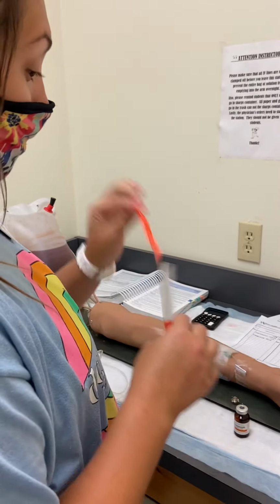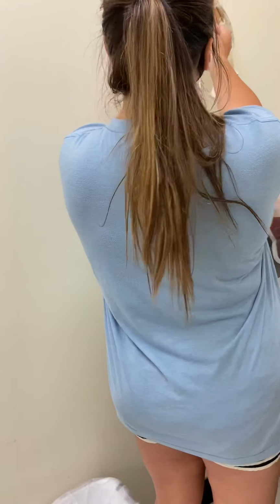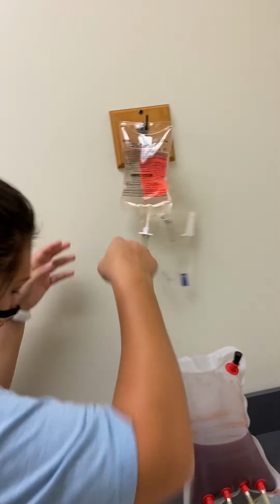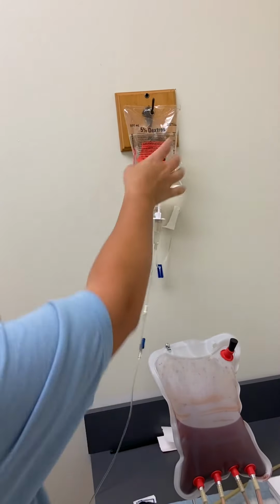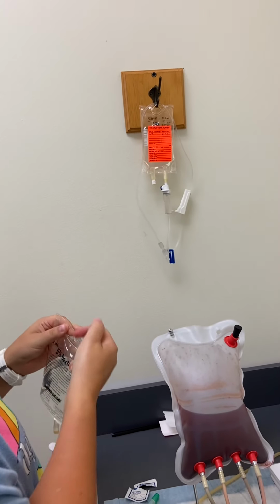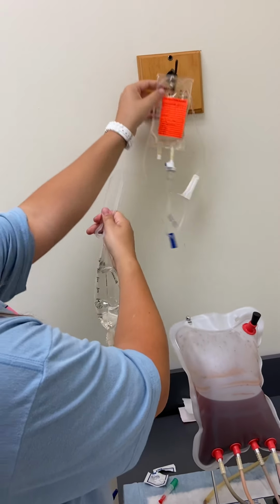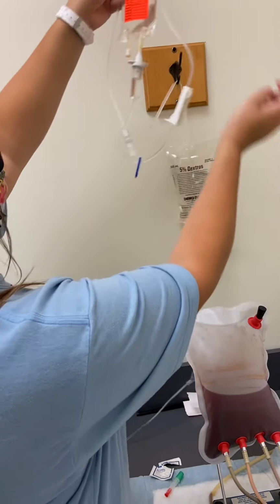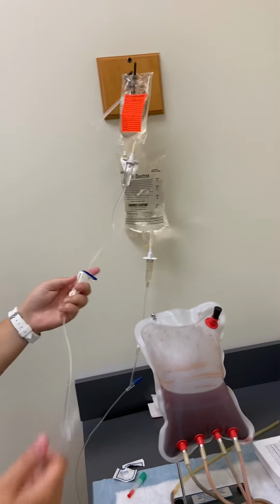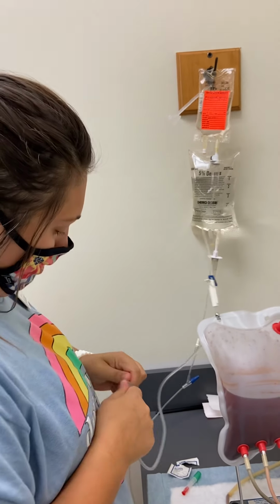I gotta put this on my label, and I would do that before I got in the patient's room. So there's my label for that. Alright, I'm gonna go ahead and give the piggyback. So I drop my primary. Alright, it's already primed, so I can just go ahead and connect it.